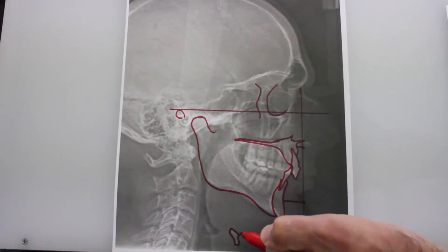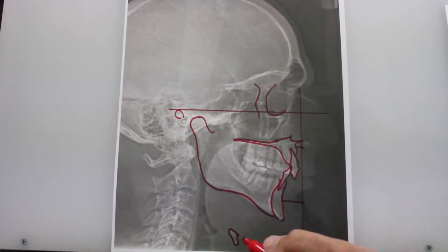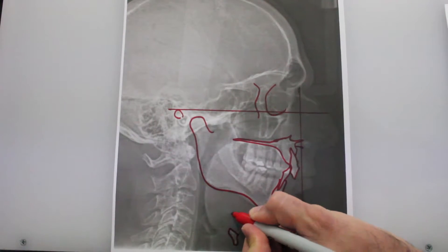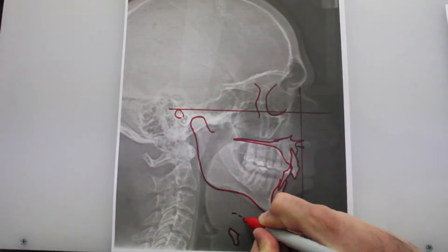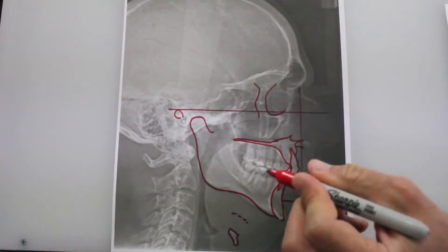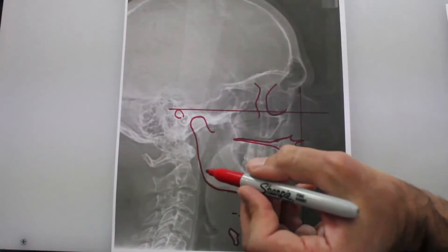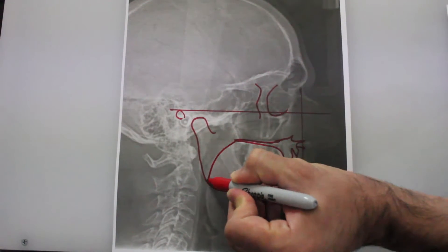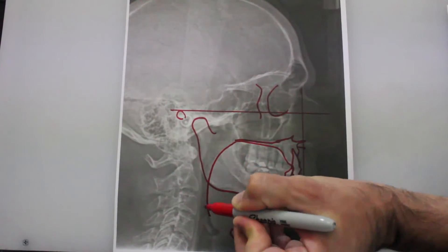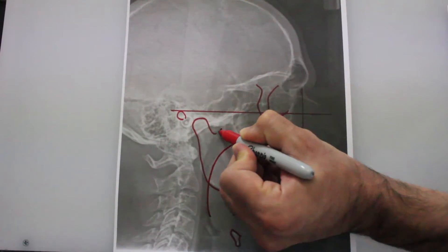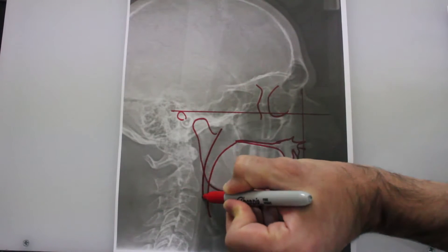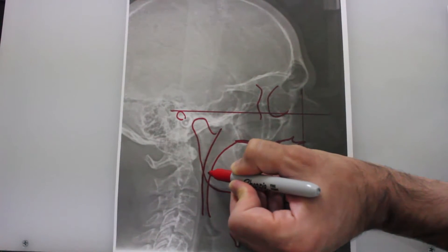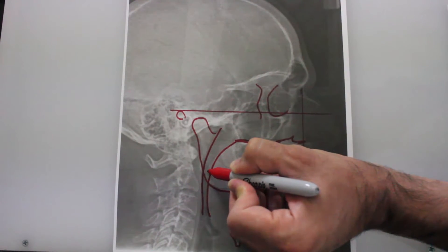This bone is very important because a lot of muscles are attached to it. The hyoid bone should really be here. The most important thing in the X-ray is the posterior airway space, which in this case is very narrow.